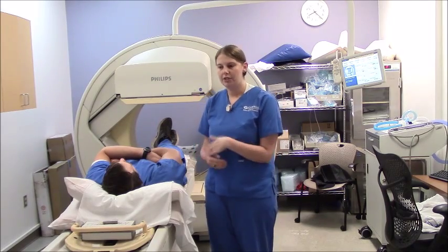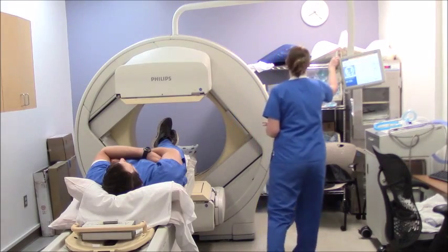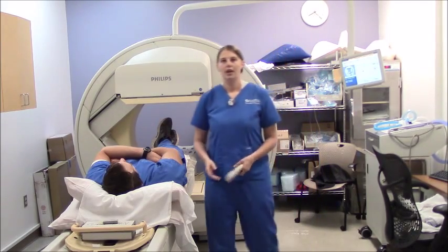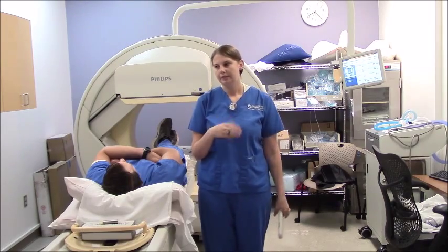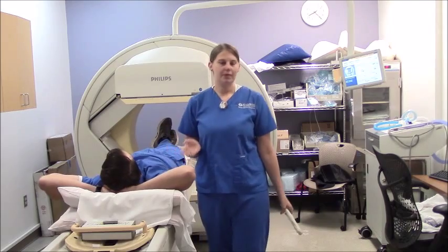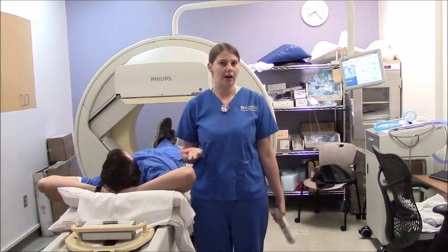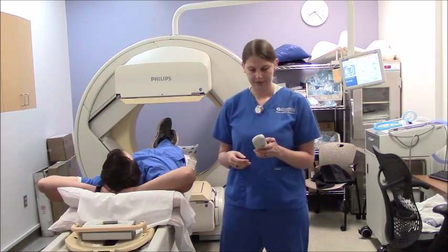After the patient is injected, you can move right into the imaging portion of the test. To get a good view of the lungs, you will want the patient's arms out of the way. Will you please raise your arms? Get them in a position where it will be comfortable for them to hold their arms like this for about 15 minutes.